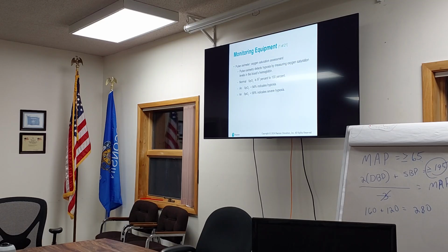Okay. We do have special meters that look just like a pulse oximeter. In fact, it's the same device that we can read where it will identify the percentage of carbon monoxide. But that's a topic for another day. So we put this probe on a finger, and some are a handheld device, some are hooked up to a machine, some are just finger clips. They're all pretty accurate. And it's going to give us a percentage.